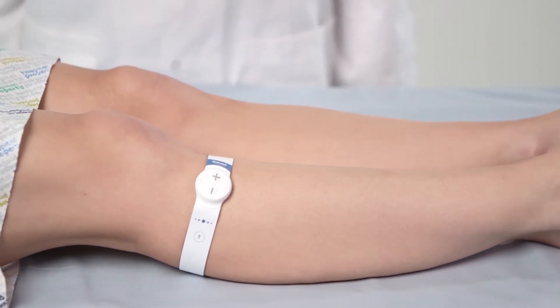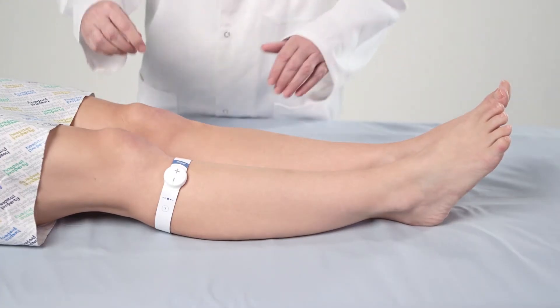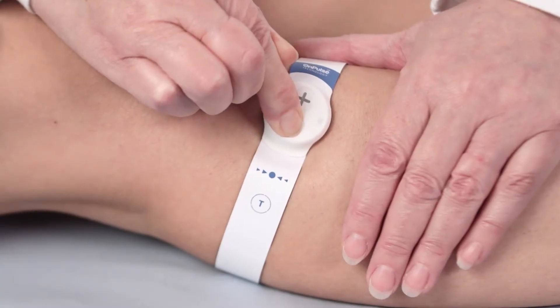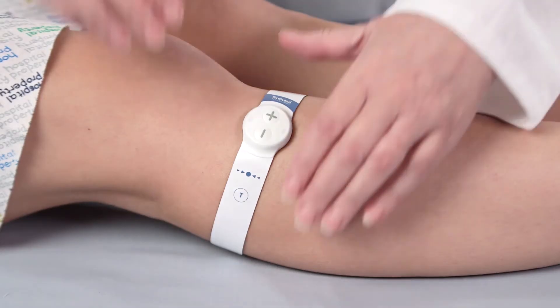Check the patient again soon after fitting the device to ensure that the Gecko is still giving a comfortable and effective level of stimulation and readjust the level if necessary. To turn off the device completely, hold the minus button down for 3 to 4 seconds. Note that when the button is pressed, the LED will flash rapidly to confirm its deactivation.